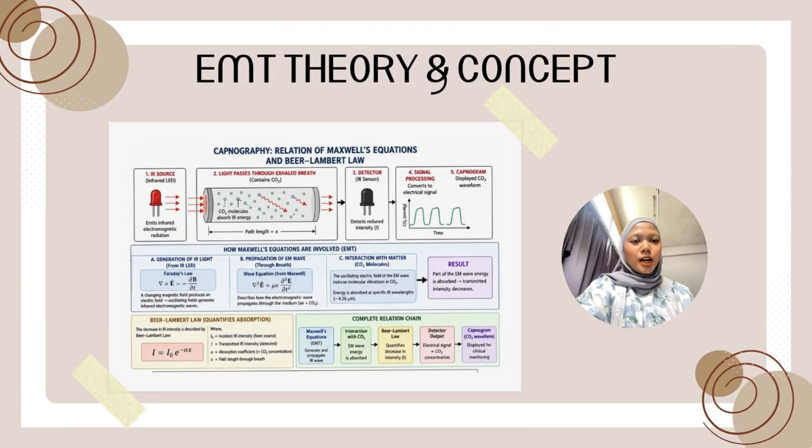So next, I'm Ms. Rina Batrisha and I will explain about the EMT concept and theory part. For our project, we applied the Maxwell equation and the Beer-Lambert law.